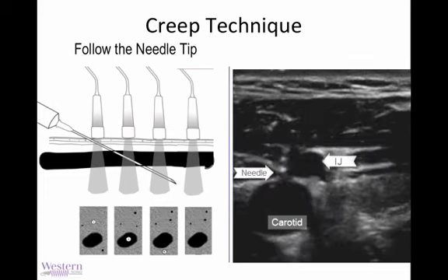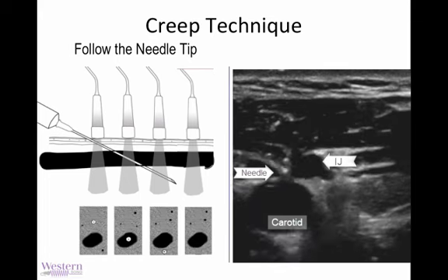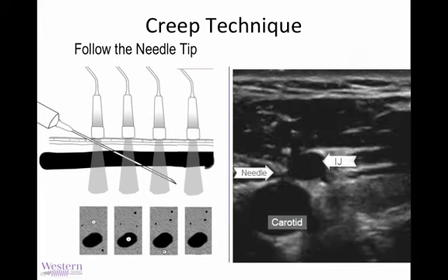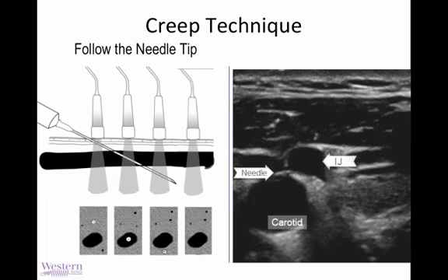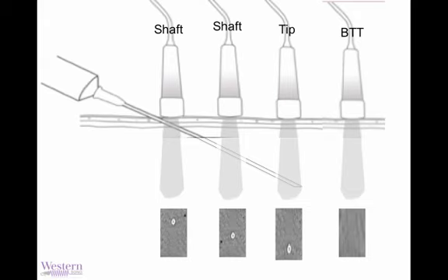Because otherwise you end up in this case. We assume this is the tip of the needle. We assume that hyperechoic lesion, or spot rather, at the IJ there is the needle, but we have no way of confirming that unless the operator has done what I've just described, in which case I don't expect it to be frantically pushing on the IJ the way they are. So we'll go through this again here.